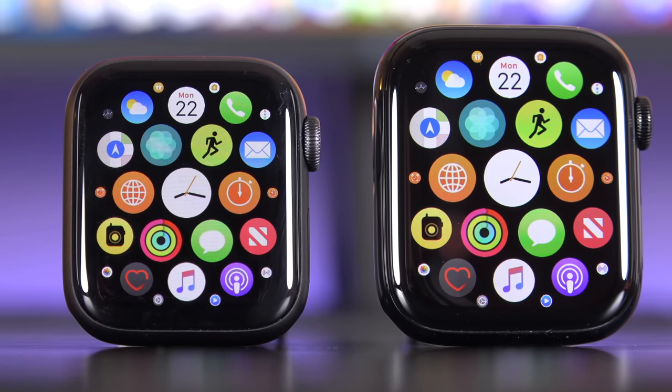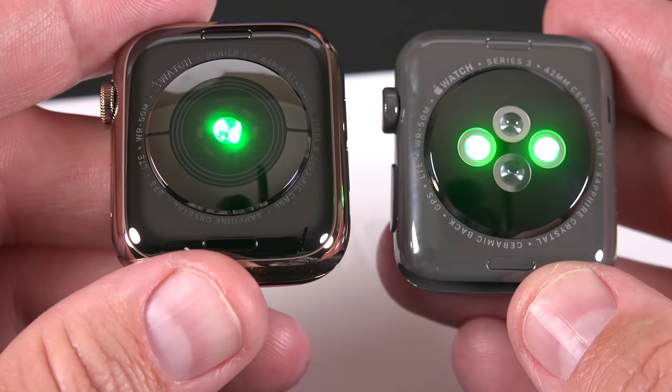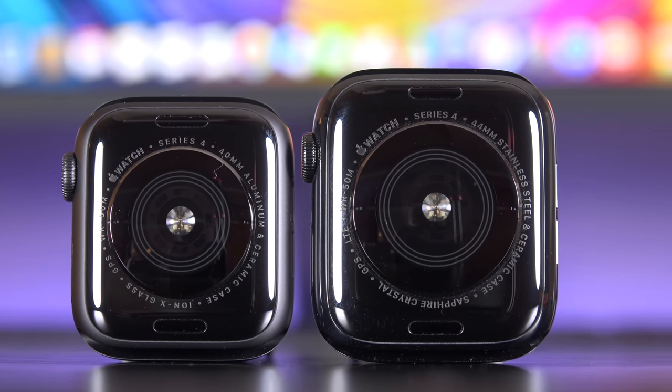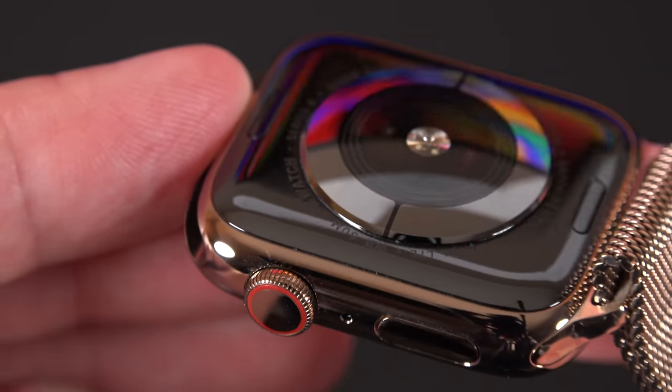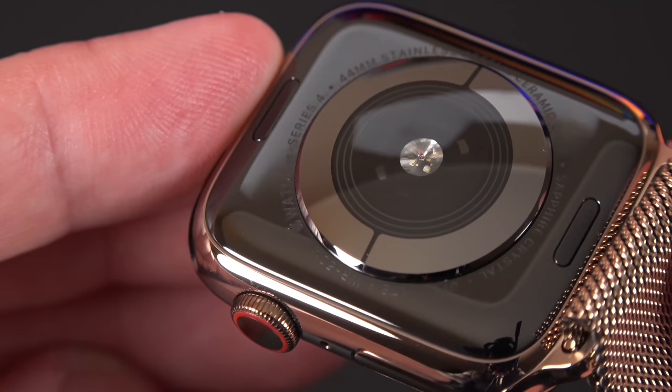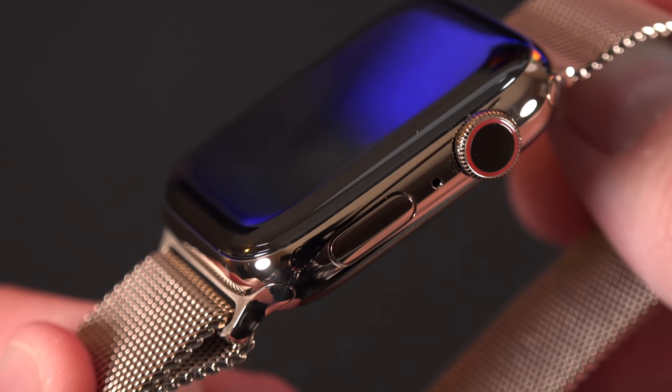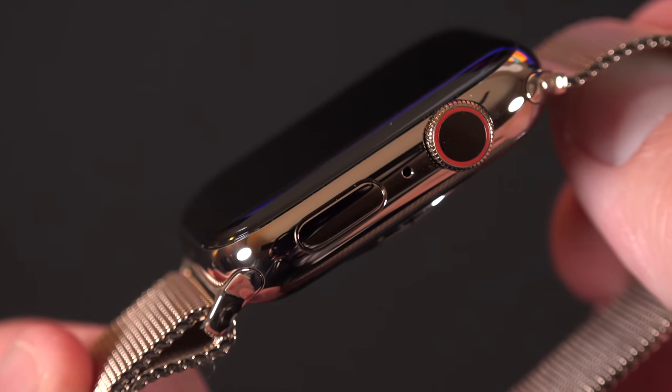As a reminder, the Series 4 Watch has both an optical heart rate sensor, which measures your heart rate, but it also has several built-in electrical leads. The back crystal has electrodes in the back which make contact with your wrist. There's also another electrode in the digital crown, which completes the circuit for measuring the electrical activity of your heart.